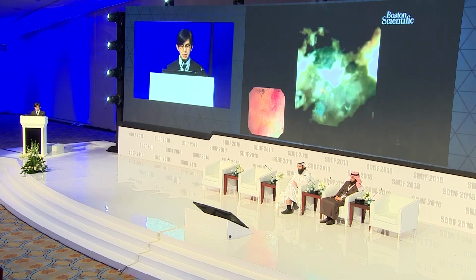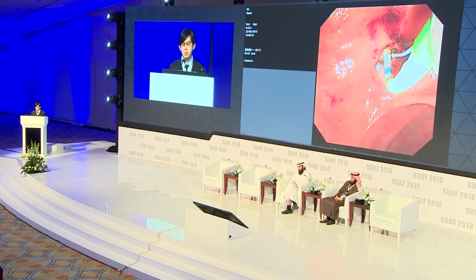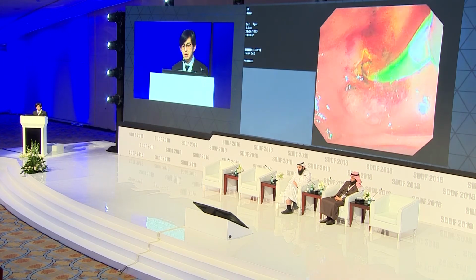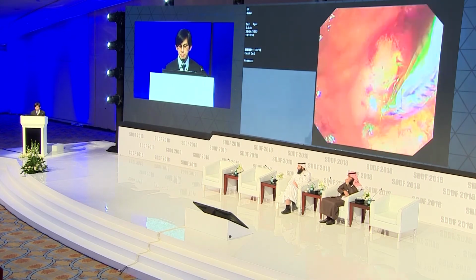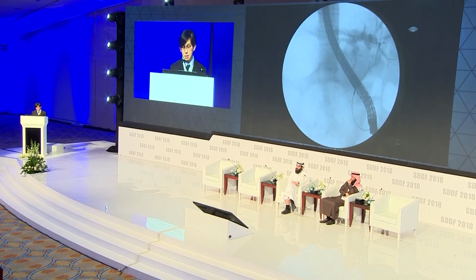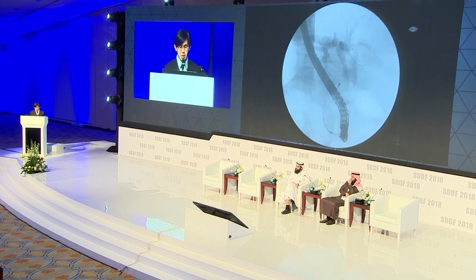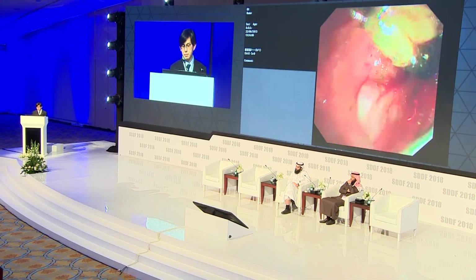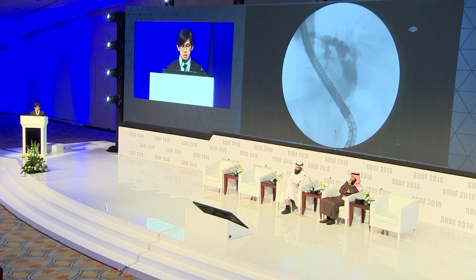Why holmium YAG laser? Because we bought the units. There are units that use EHL. I think it probably works equally well, except with EHL you really need a lot of fluid, and with the laser, you don't need to put in as much fluid. After fragmenting the stone, the stone became more mobile, and they were able to complete the procedure using a BML. We'll just show you a little bit of the video, and that we were able to clear the bile duct in one setting.